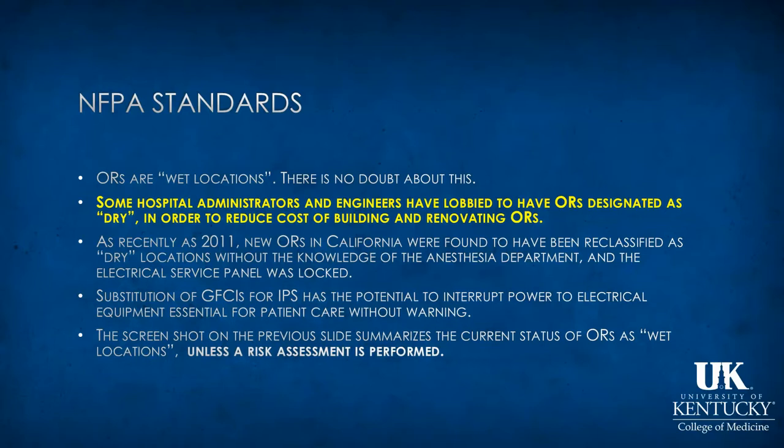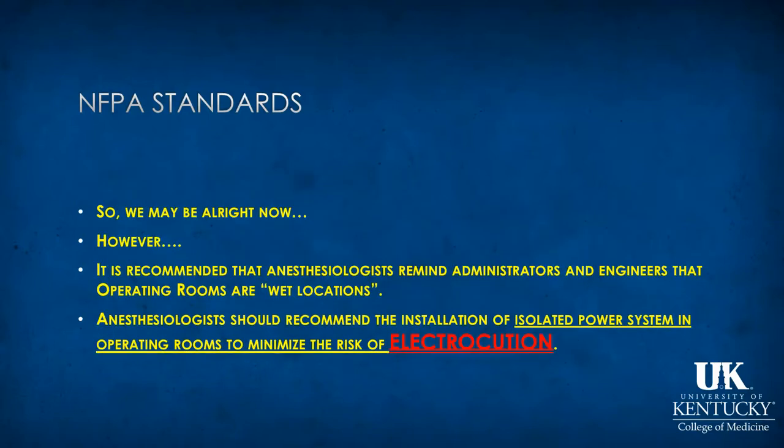Let's see now. So we may be all right now. However, it is recommended that anesthesiologists remind administrators and engineers that operating rooms are wet locations, and that we should recommend the installation of isolated power systems in operating rooms in order to minimize the risk of electrocution.